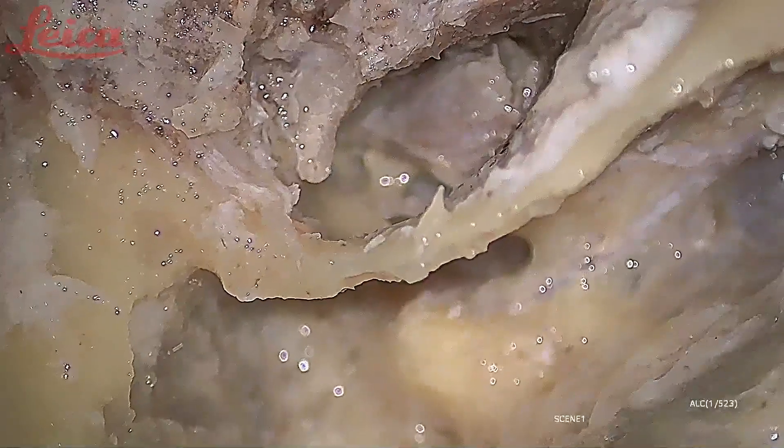I'm just cutting the tensor tendon. Dr. Vinay, can you just adjust the microscope and do a fine focus?